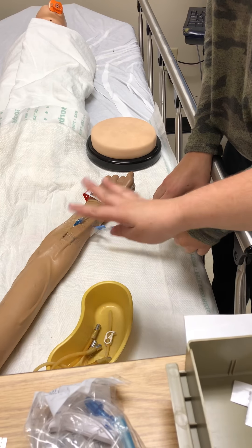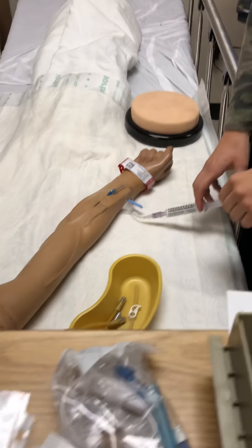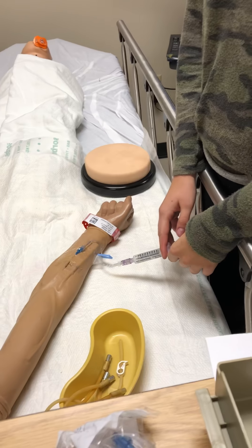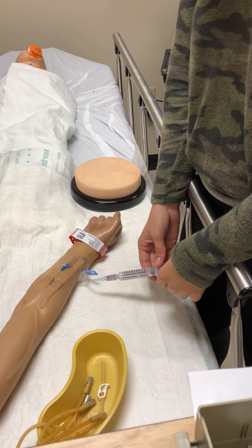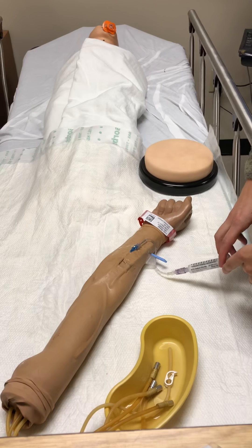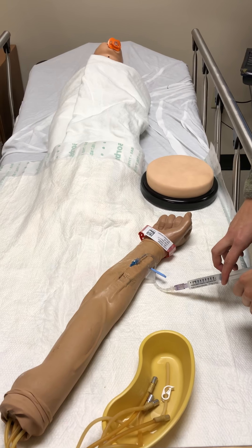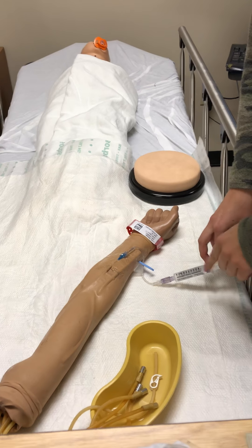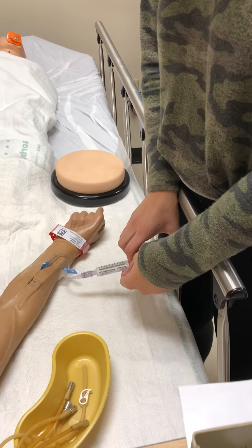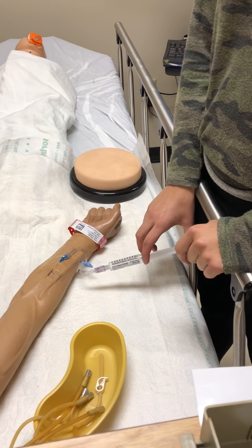You would clean the site and assess the site. Do we pull back and aspirate? This is the saline flush. With the saline flush before we administer — you could, but you don't have to. It's completely full. And if you just flush it — but you have to flush. If there's resistance, we just check that.